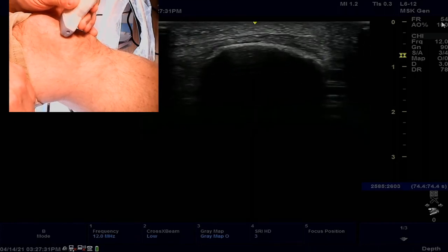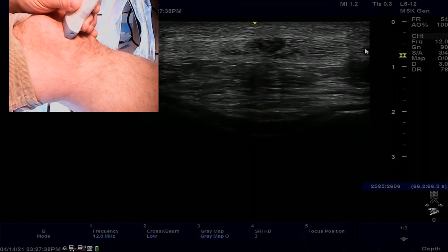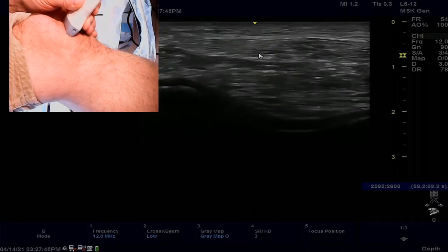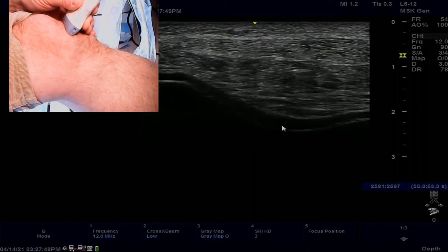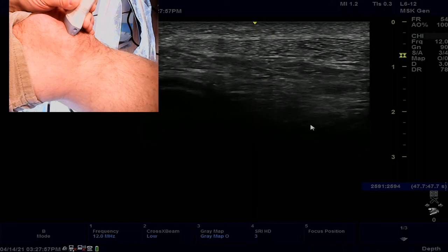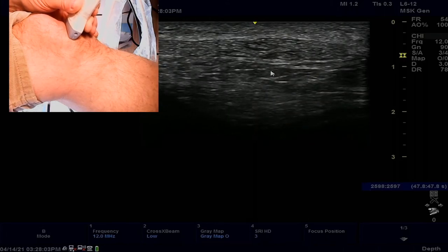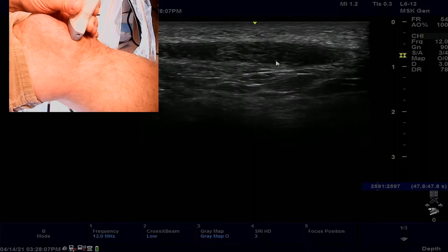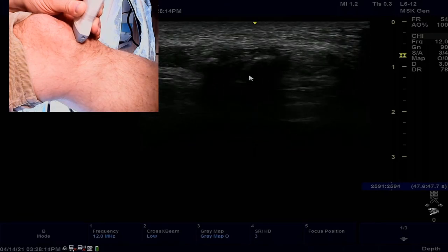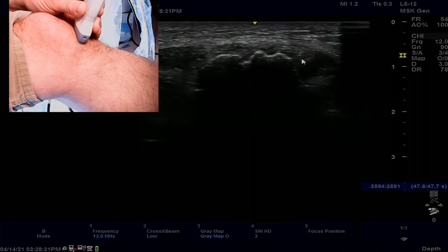Going from patella and sound shadow, we start to see tendon in transverse view with an oblique fibrillar structure. Looking upward we can see cartilage associated with the trochlear notch — this is a sub-patellar view looking up under the patella sitting in the trochlear notch. Below is all Hoffa's fat pad, and tendon at the top. Coming in toward the distal attachment points we see Hoffa's fat pad and then the bone of the tibia starting centrally.